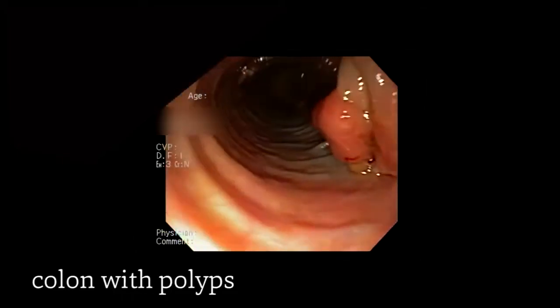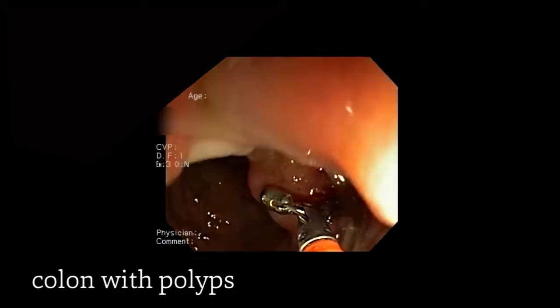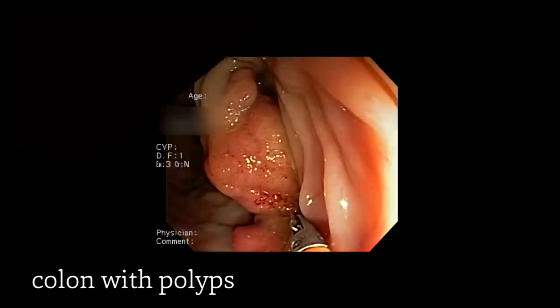Here you'll notice a very large colonic mass. This is something that could not be removed endoscopically, and so we chose to use what's called a forceps device by which we can take biopsies.